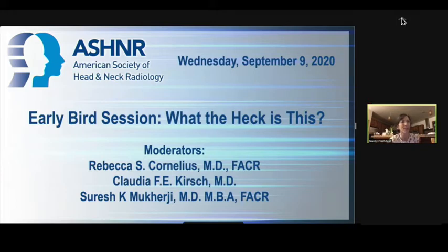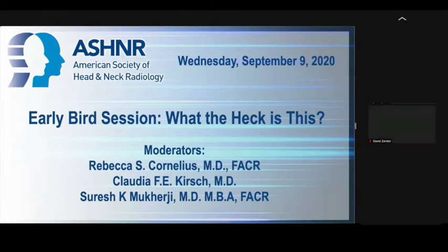So thank you. No, I agree. I don't think any of us would have jumped to amyloid on our first choice looking at that case. It's really fascinating. But it is these infiltrative inflammatory processes that occur can track exactly, like you said, along these nerve pathways and involve these cranial nerves. So really unique and beautiful case.